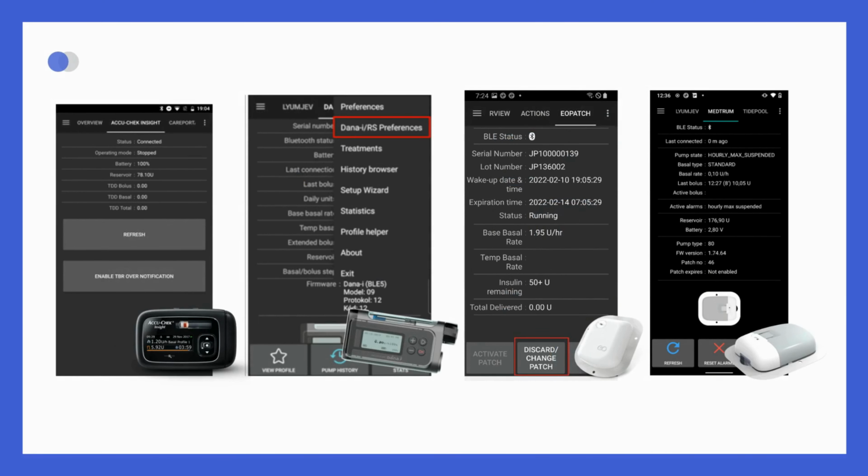For users of other insulin pumps, the app interface will display different options corresponding to the specific pump type. Each pump type will have its own dedicated tab at the top. The available options and settings may vary, depending on the pump model. These settings ensure that you can effectively manage and control insulin delivery through your linked pump using the AndroidAPS app.